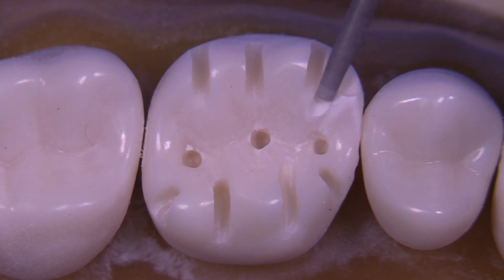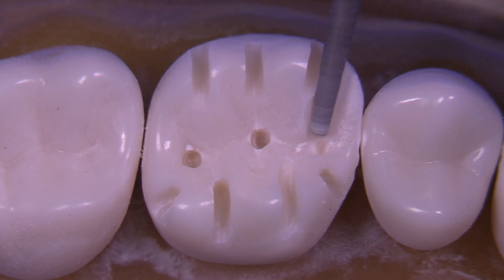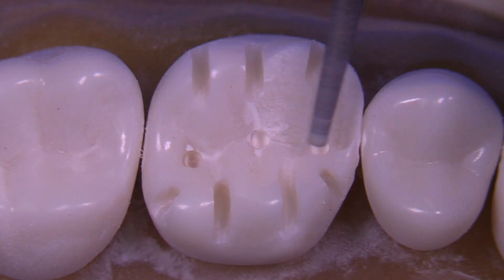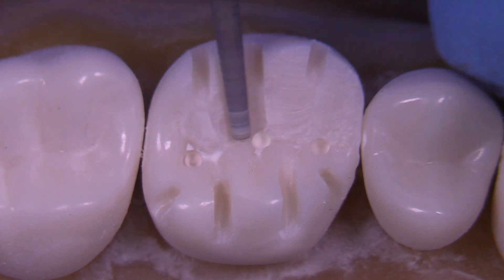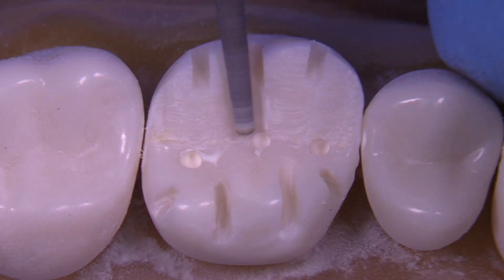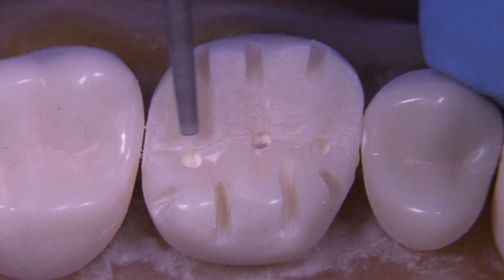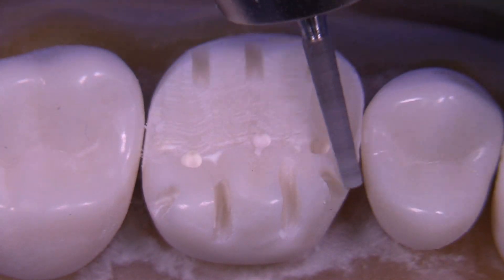This is a 6847-016 and the reason for this diamond is that it's 1.1 millimeters at its tip and 1.6 millimeters at its widest area. That works out pretty well for us if we just understand the measurements of those two portions of this diamond. Right now I'm just making the typical pattern across the c-plane, which would be the sail shape on the distal and the sail shape on the mesial, and in the middle the open book type of look.